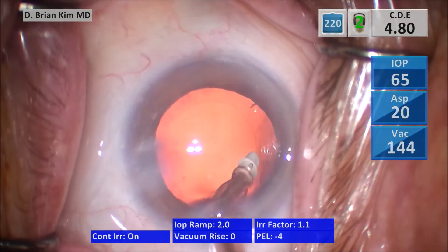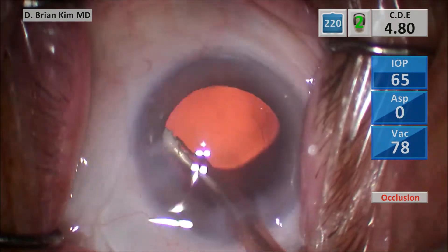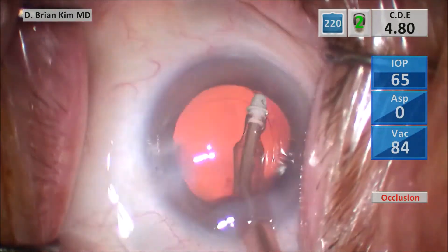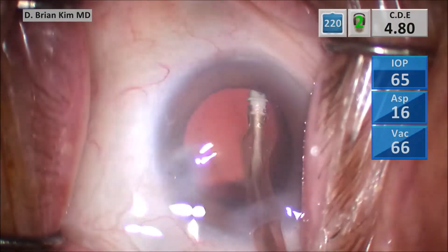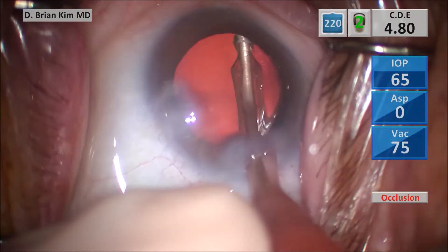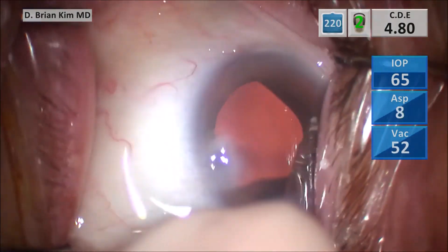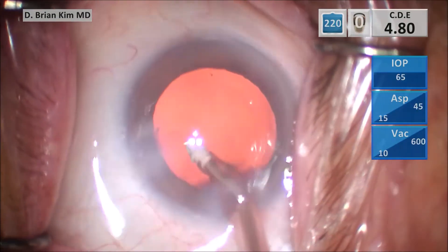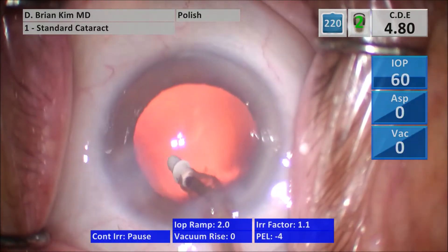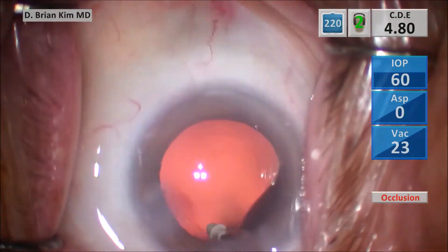You can see the patient still has a strong Bell's reflex. Every time I go in and out of the eye and irrigate fluid on the eye, the patient squeezes and the lens again goes up, which is to the right on the screen. I'm in cortex mode, polishing around the anterior capsule, then switch to polish mode and polishing on the posterior capsule as well, and polishing underneath the anterior capsule. This is really a pretty clean bag in this case.